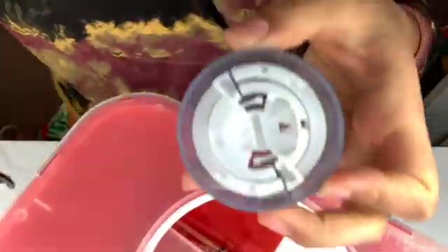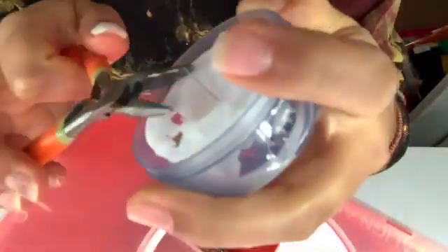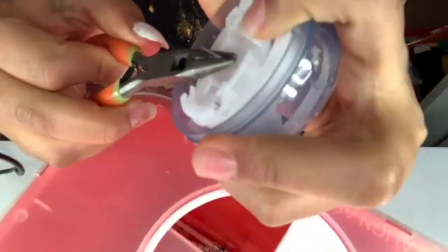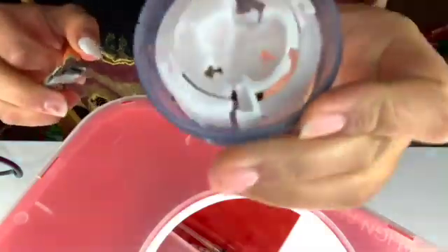So now what we're going to do is dispose of our needles. So put that in the sharps container, and then in order to save space in your sharps container, use a pliers specifically designated for this and just pull out the needle from your inset and then put it in there, and it saves so much space, and you could just recycle that.